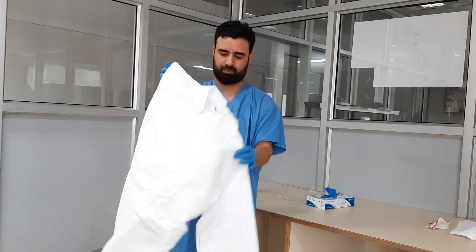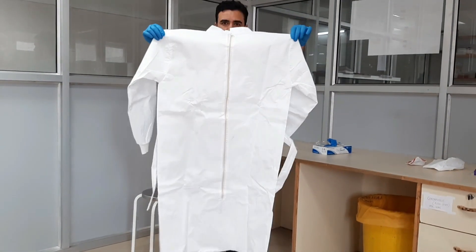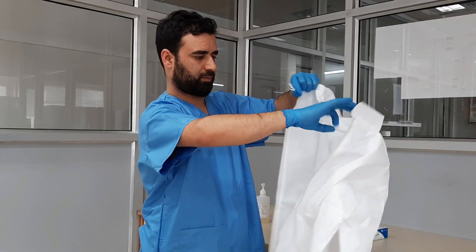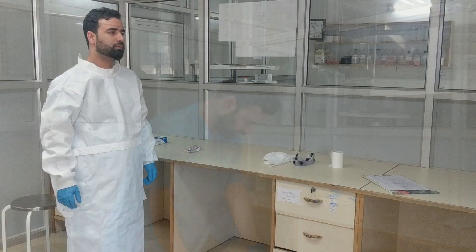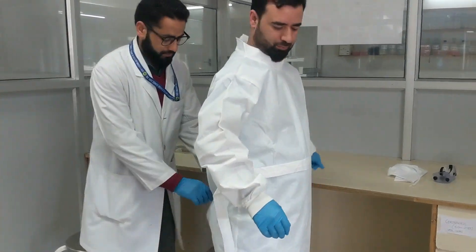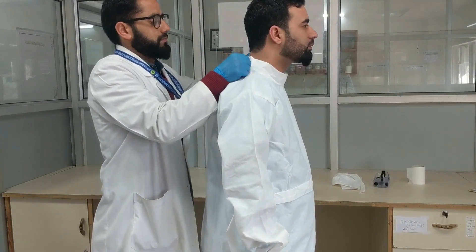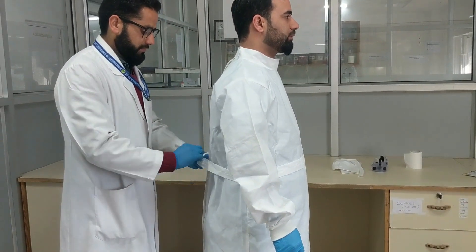Now remove the PPE gown from your kit and unzip the PPE. The PPE can be donned by pulling it towards your neck and covering your body as shown in the video. Pull the zip of your PPE and close the flaps behind your neck. Additional assistance can be taken to ensure that your PPE is right in place.